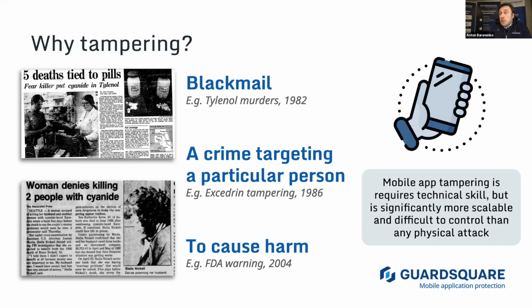For example, we are aware of a medical device company who had a risk of their device communication protocol being reverse engineered in order to add extra or third-party functionality to the application. And patients sometimes don't know what they are doing, and they are trusting their own manufacturer in order to add those nice-to-use extras, which in the end result in patient harm.